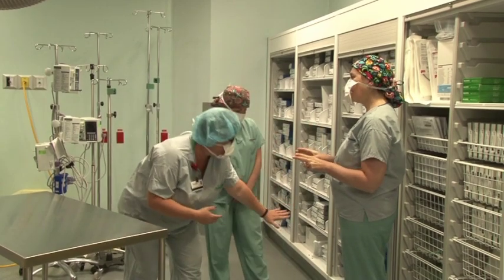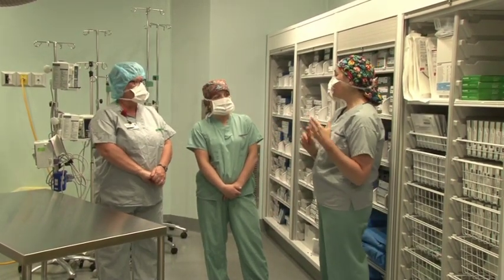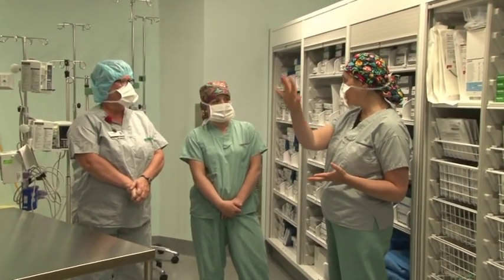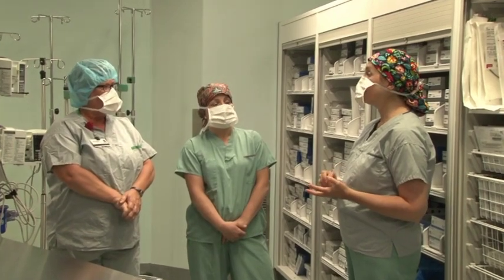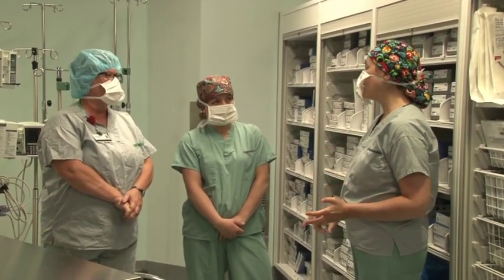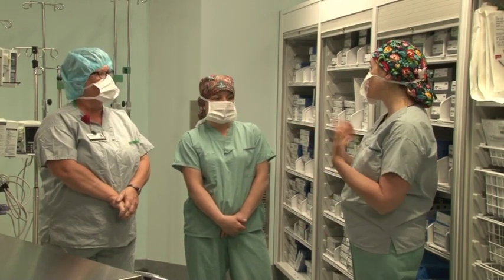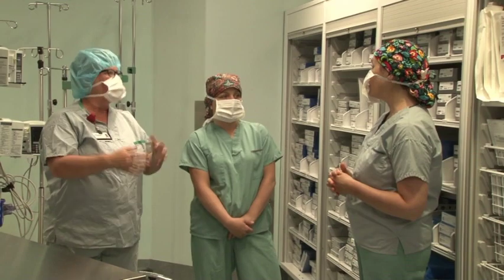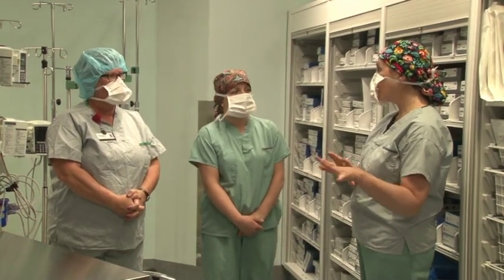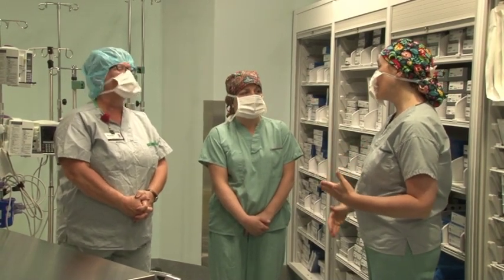There's two choices of that right now, Sue, actually. You can do the temporary here. If the cardiologist on call wants to come in and do a temporary pacemaker, they'll do it here. If the cardiologist decides he prefers having an interventional cardiologist, then that patient will be taken downstairs to the cath lab. So we have two areas to put in a temporary pacemaker, so it's on the decision of the cardiologist on call. We've had a couple already put in here by cardiologists, but I would say the majority nowadays they are calling intervention, and we're taking them downstairs.